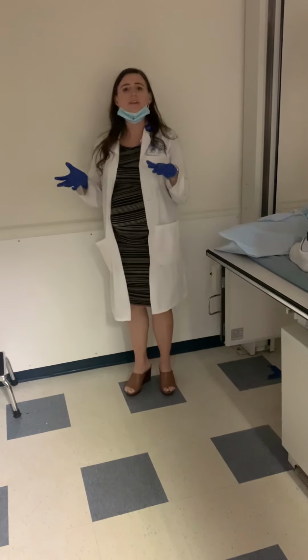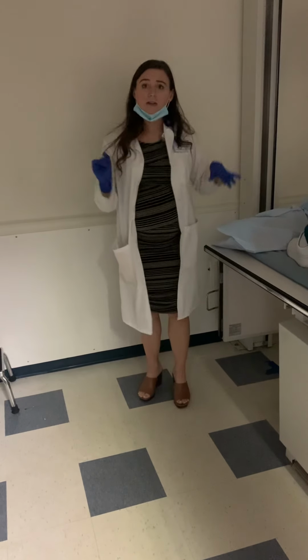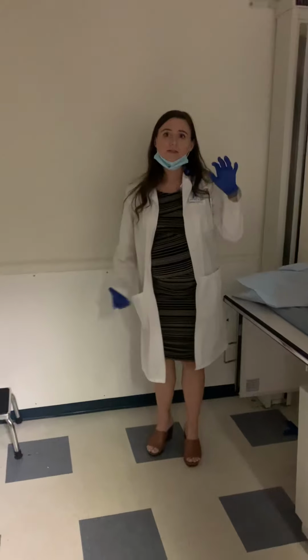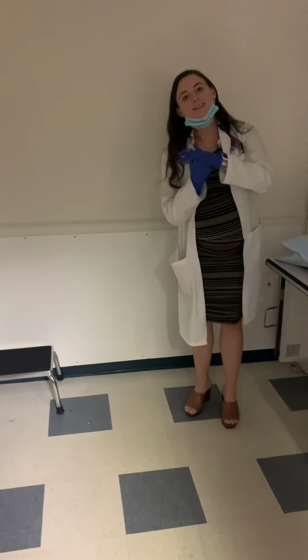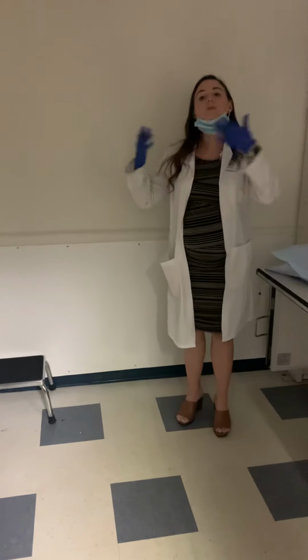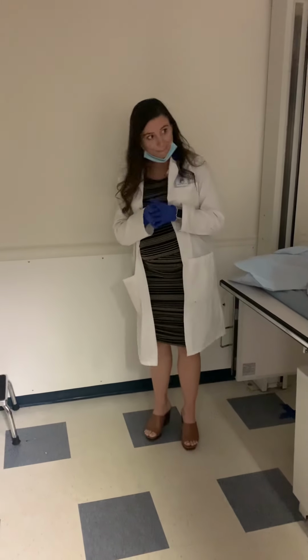Somebody asked about shielding for this one. If you were doing this under fluoro, you would never shield because remember, fluoro is upside down. So the beam is at the bottom. So if you shield the thyroid for this, you're literally making the x-ray stick in the patient. It won't go through the thyroid, so it's just stuck. So as far as your comp goes, you wouldn't be shielding. Post films, you technically could shield the thyroid if you wanted to. But fluoro, and this could be done under fluoro, you cannot shield anything. So no shielding when you comp for this one.